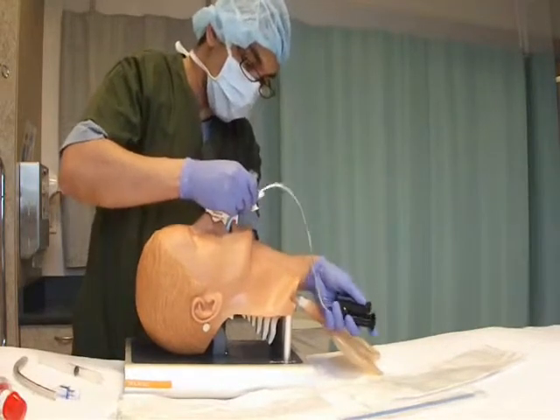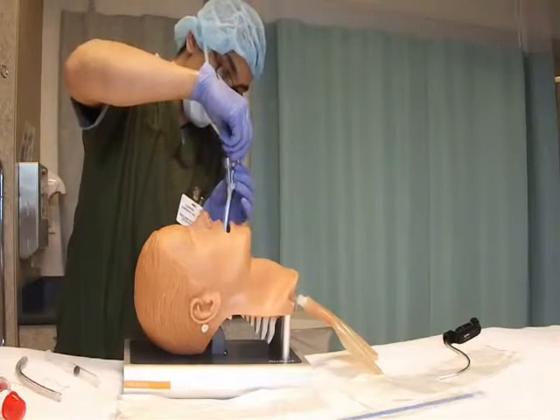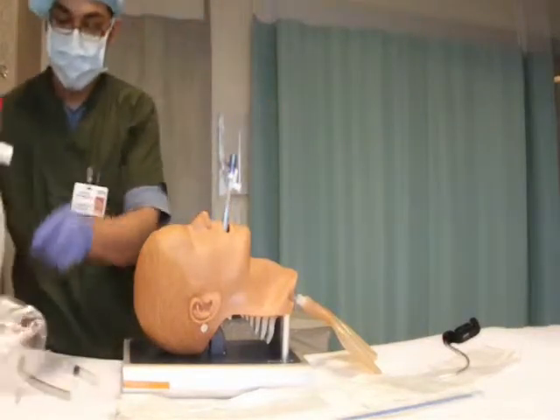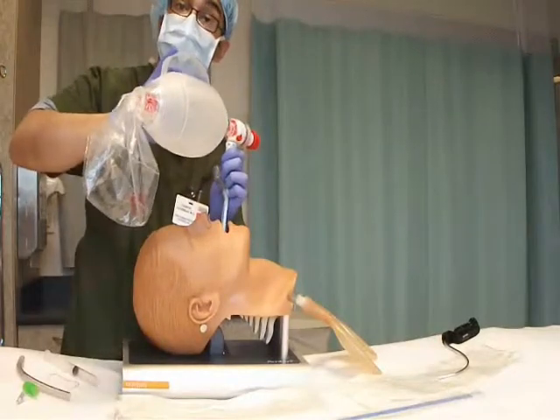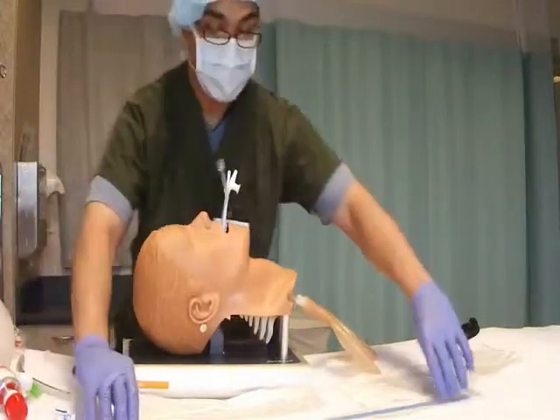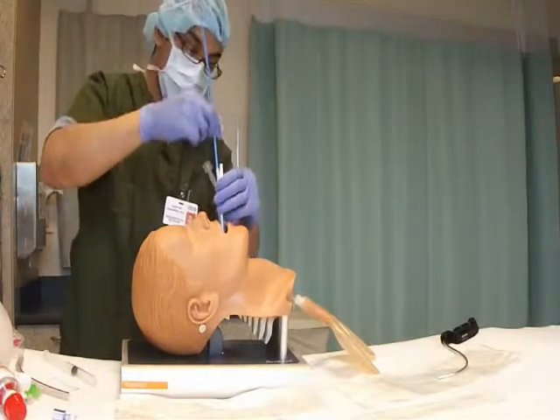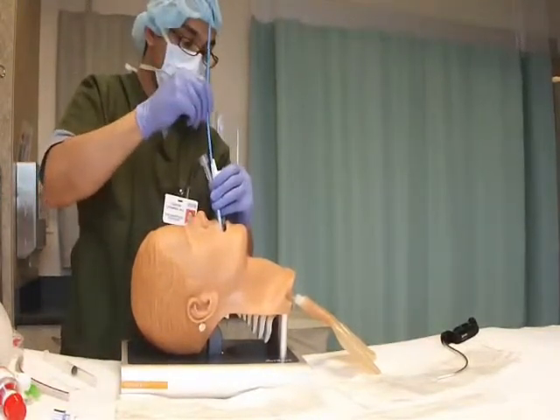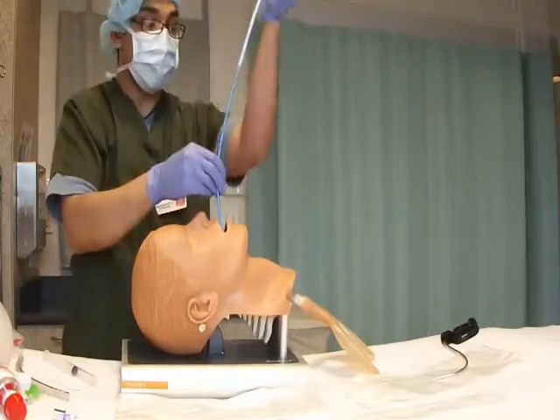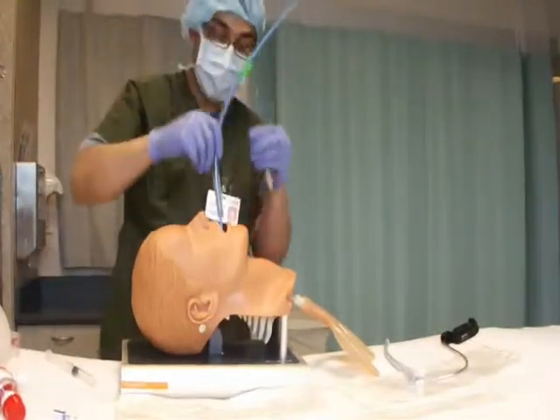In a patient with a stenotic airway, the multilumen endotracheal tube introducer can be used without an endotracheal tube by itself. However, it has a 15mm adapter that goes onto the lumen meant for the RFS. In order to establish a definitive airway, a normal airway exchange catheter or tube introducer can be placed through the lumen meant for the RFS shaft. After this, tube exchange takes place normally by putting an endotracheal tube into the trachea.